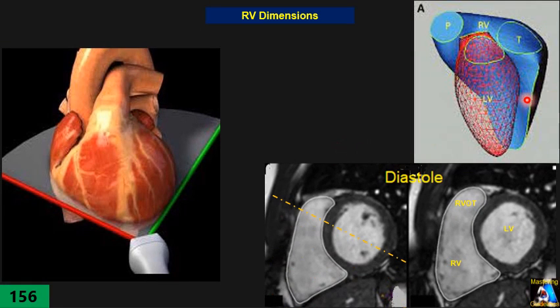The right ventricle has a unique shape, opposite of the left ventricle that has an almost cone or bullet shape. The right ventricle has a triangle shape, especially at the base of the RV. You can see up to the mid, we can appreciate two regions or areas here. This region connects to the pulmonary RVOT, the anterior part, as you can see here.